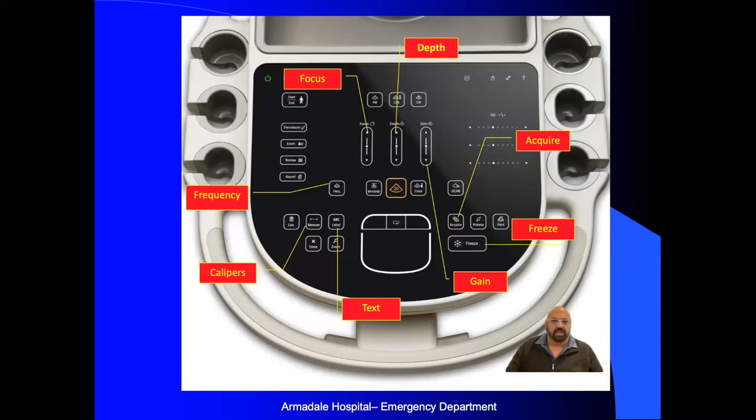Once you're in the process of scanning, the two most important controls are depth and gain. For gain, you can either press the buttons at the top or bottom, or use the touch-screen slider to increase or decrease it. This is the overall gain. If you want to use DGC for the near field, far field, or midfield gain, you can slide your fingers over that area of the touch screen depending on where you want the gain increased.